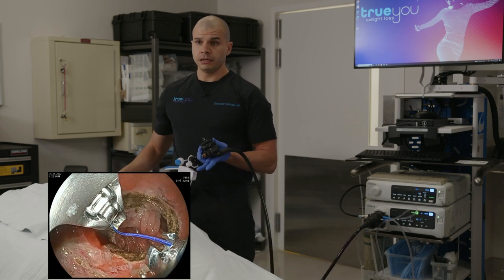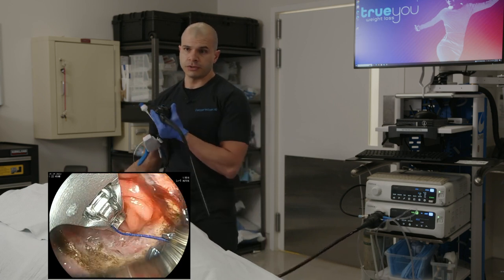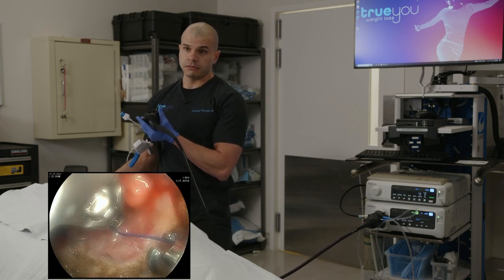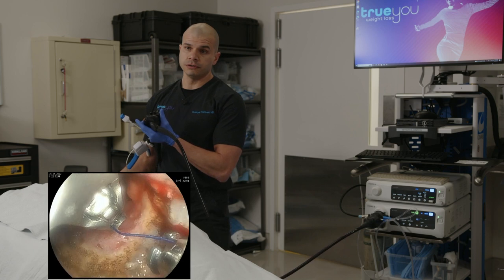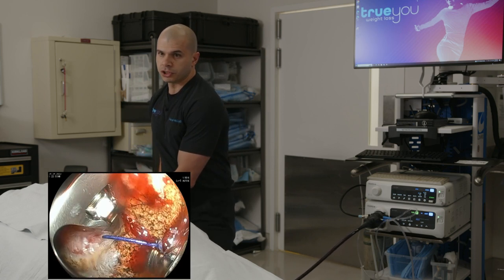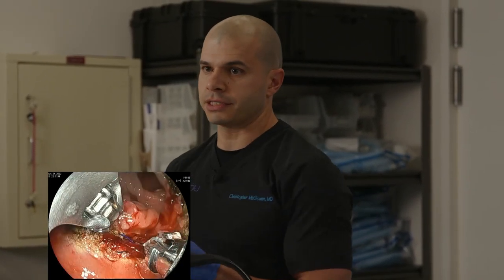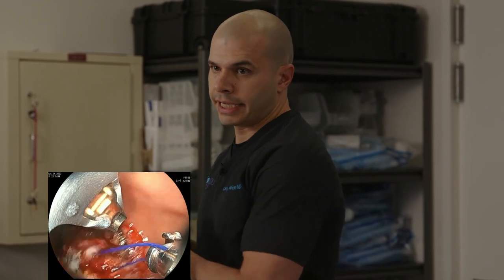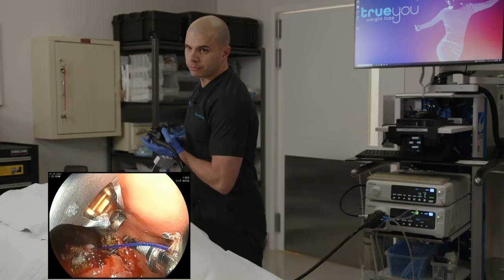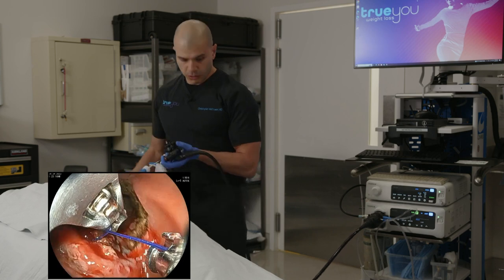So to begin, I'm going to rotate the scope about 180 degrees. Now, in general, I'm not going to use a grasper, a helix, or any other device to assist this. We're going to use the anatomy to our advantage. We have a curved needle, and we have a ridge at the anastomosis. So this needle will cross from jejunum to gastric side. And then I'll repeat the process, rotating the scope in a counterclockwise manner to come all the way around. I'm always loading the suture in the direction I'm going, so to the right of the trailing suture. And I'm just going to repeat the process all the way around.